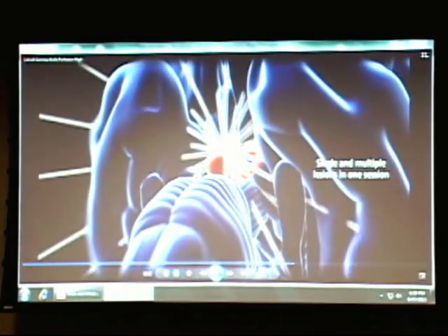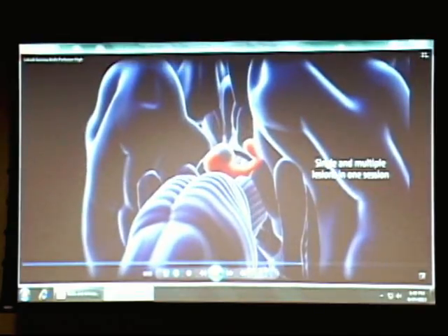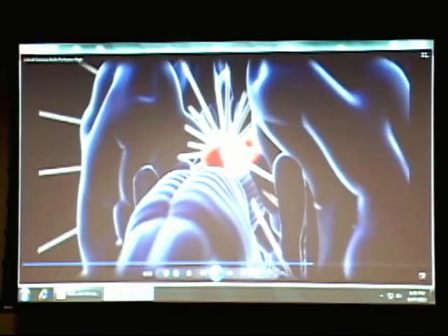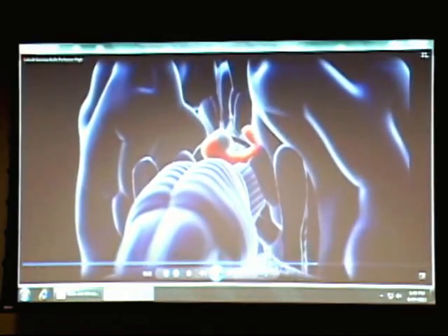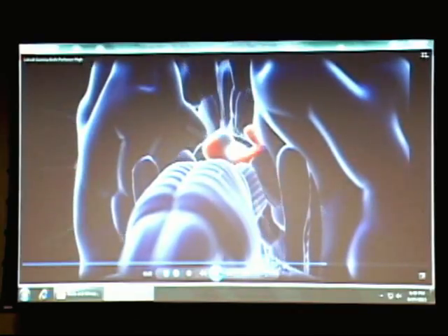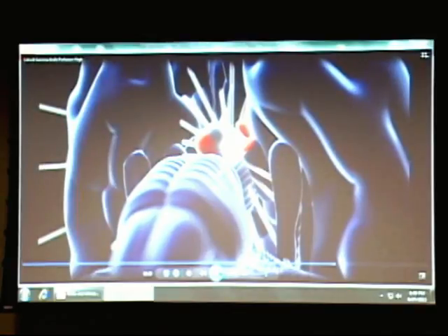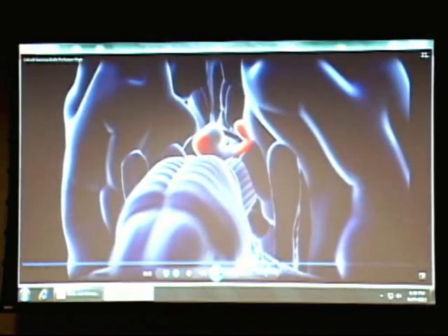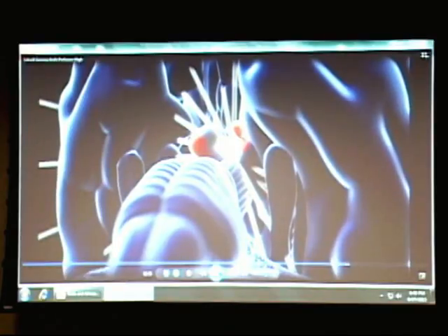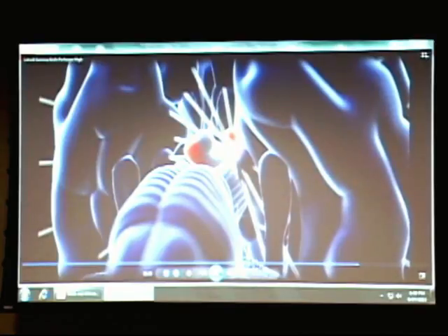So the patient has another tumor here, for example, adjacent to the brainstem. This can be picked off with tremendous precision. And what we mean by picked off is, the way the gamma radiation works, it disrupts the DNA in the tumor itself. So the DNA gets disrupted and stops replicating. It's basically how that radiation works. So it stops the tumor from growing. In some cases the tumors just disappear, and in some they just stop growing, which is just fine.